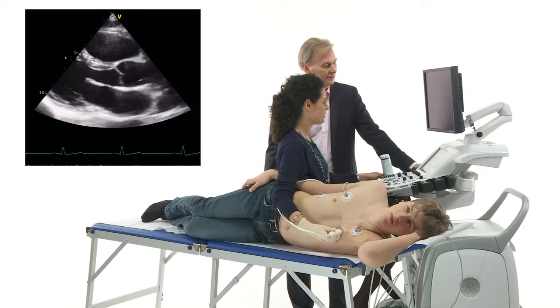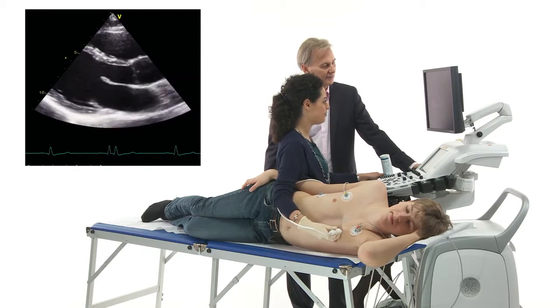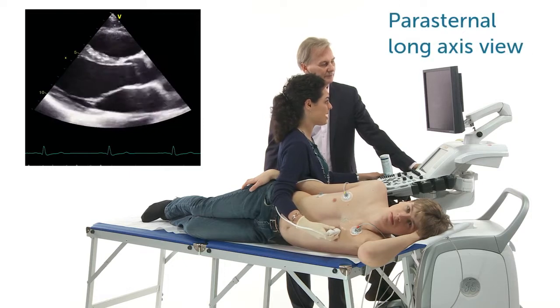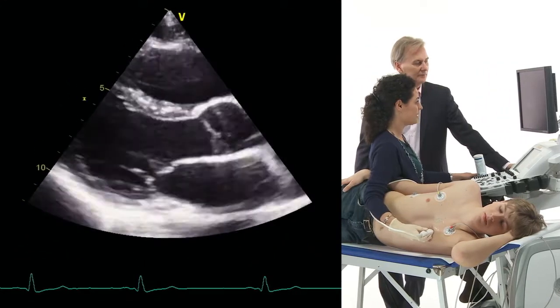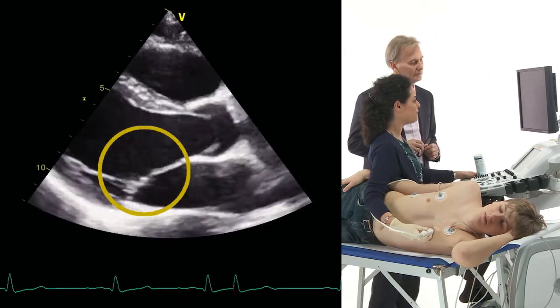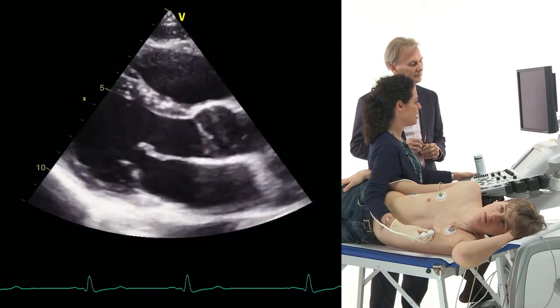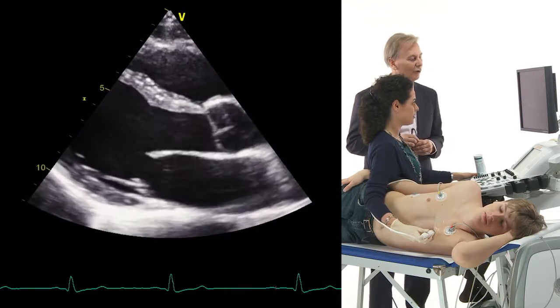Exactly, Thomas, here is the mitral valve. I guess our colleagues are already able to recognize this view. We are using a parasternal long axis view, but now our focus is on the mitral valve. So we can see the mitral valve opening during diastole and closing during systole. I think it's a normal valve. What do you say, Thomas? Yes, it's an absolutely normal valve.